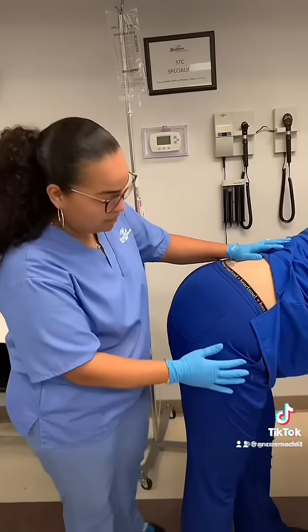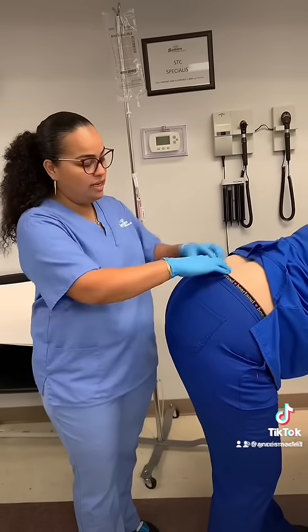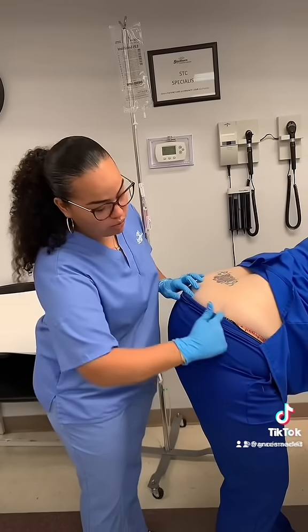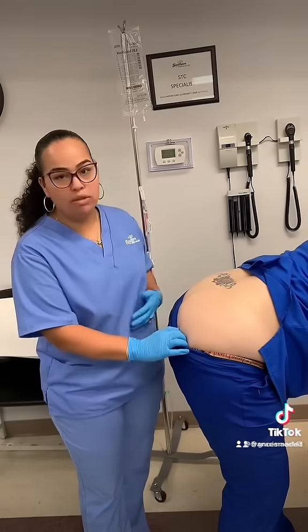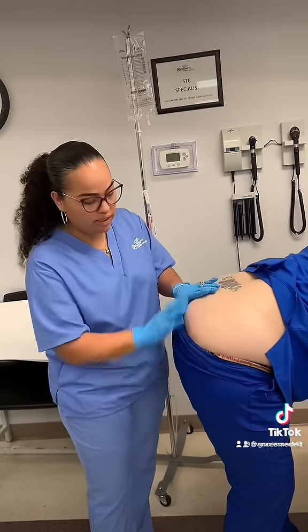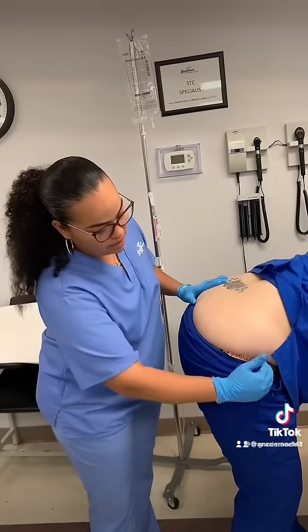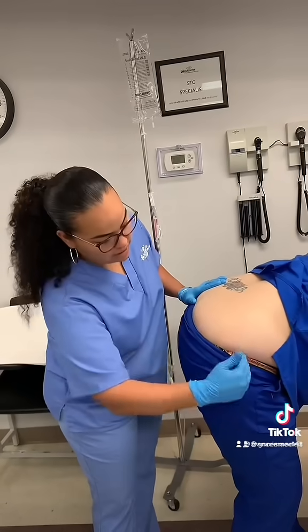Once you have your patient like this, the way you identify your breakdown of the quads — you've got to come down and make sure you find the crack of the patient. Once you work your way across, this is your guide. You don't have to pull the pants all the way down; this is all you really need. You go across — it is four quadrants, and it's always in that top corner.